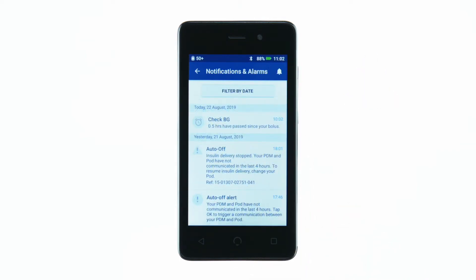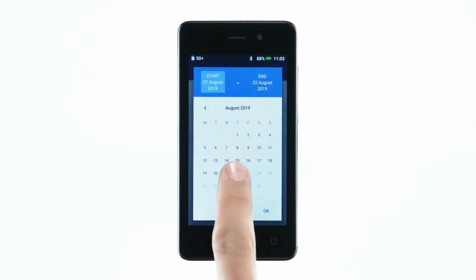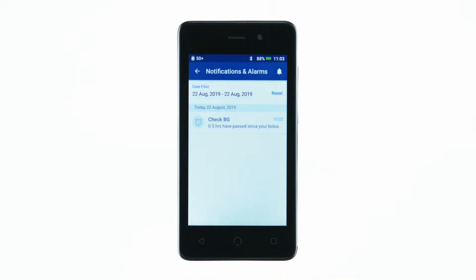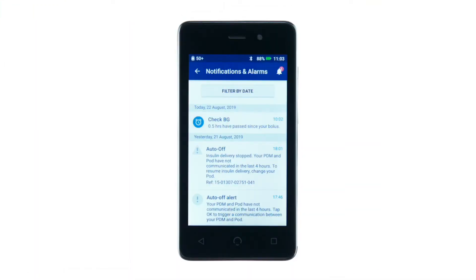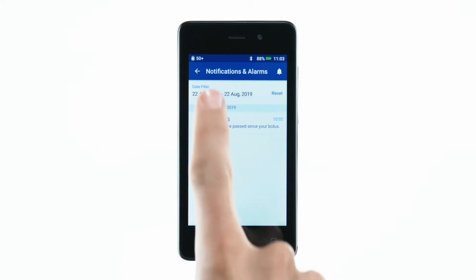You can look at a specific date range with the filter by date button. New notifications are represented by a blue icon, while ones that you have already viewed will show a grey icon. When you're done browsing the alarms and notifications, tap the back arrow.